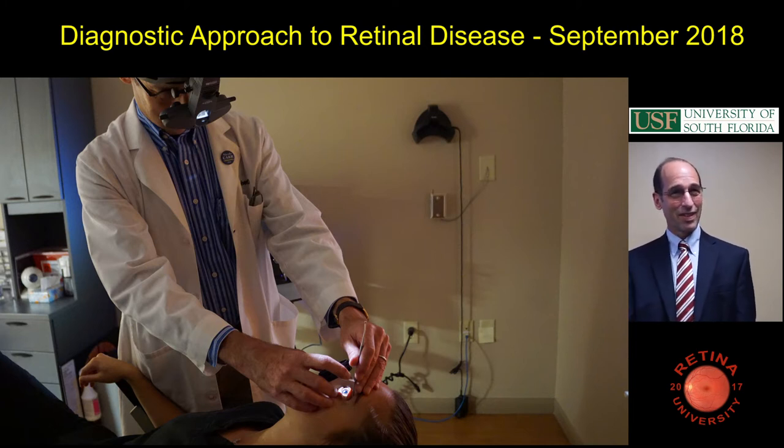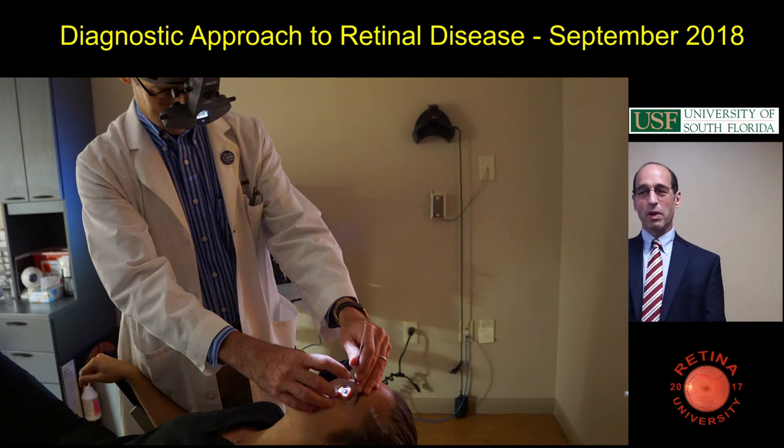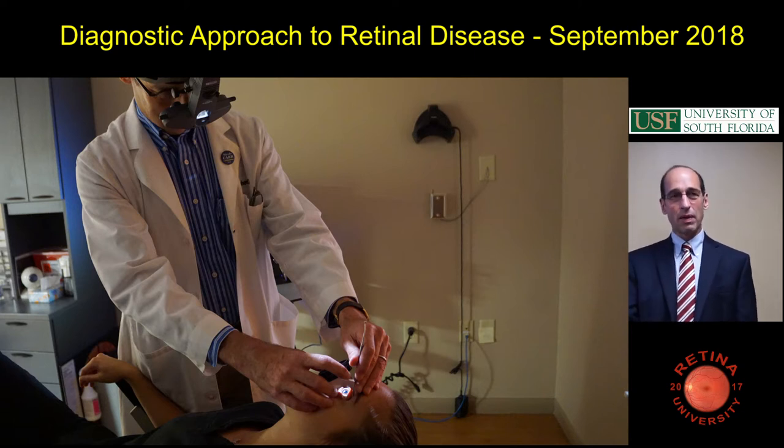Any tips for people that are trying to learn scleral depression, to be better at that? There's a couple of things. One is make sure you're lined up. Look at where your depressor is, look at the pupil and where you are, and make sure you're not side to side.